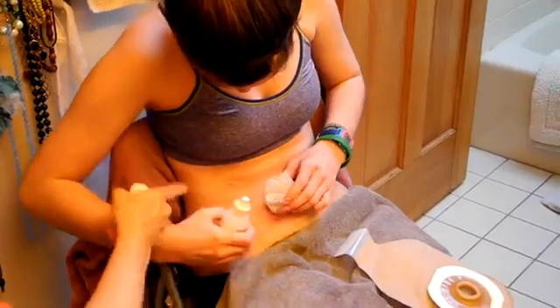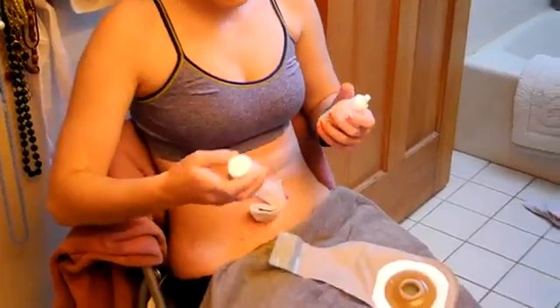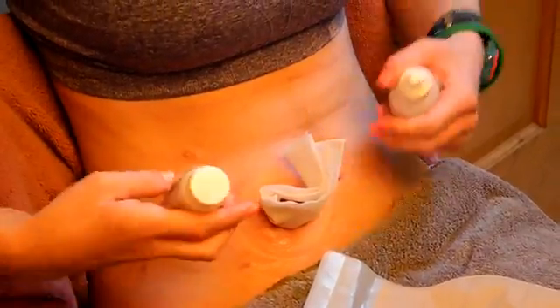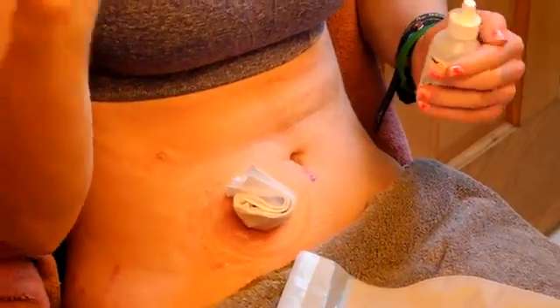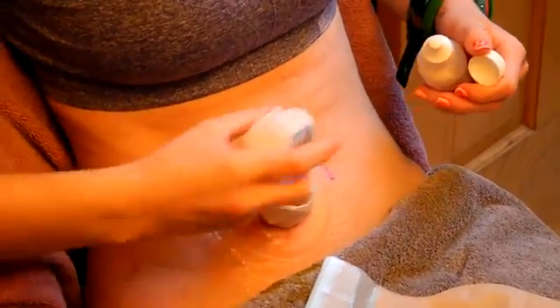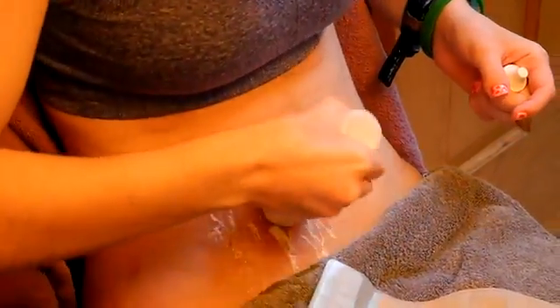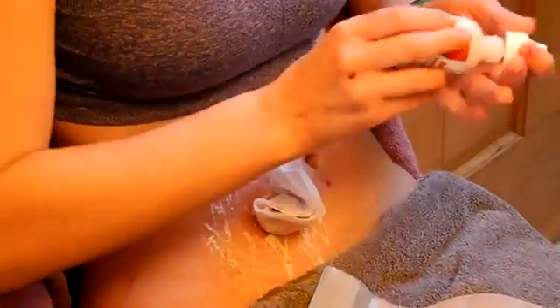You've got a few red dots here, and I wonder if those... Okay, so this is another thing that I have a problem with. I get this kind of yeast infection around my stoma, so it looks like just a bunch of little dots. I don't have it too bad right now, but we use this nystatin powder just on the area where it looks like it may have a little bit of yeast. And then the rest, I use just the regular stoma powder. And you just kind of nicely put that around. Kind of get it underneath too, where the stoma is.